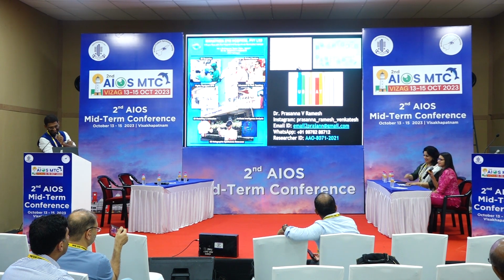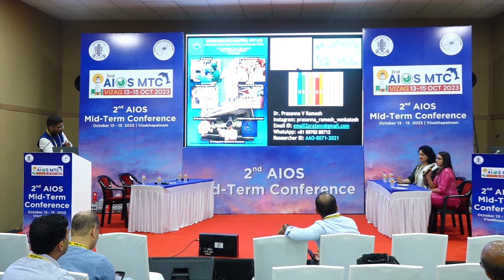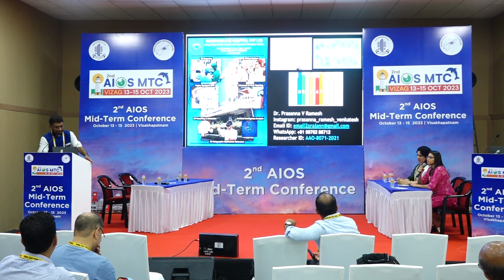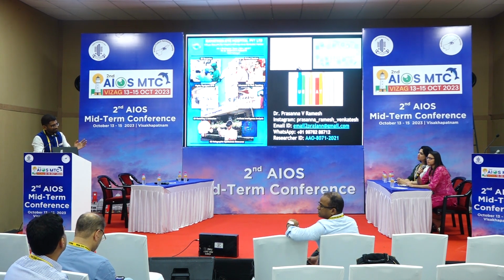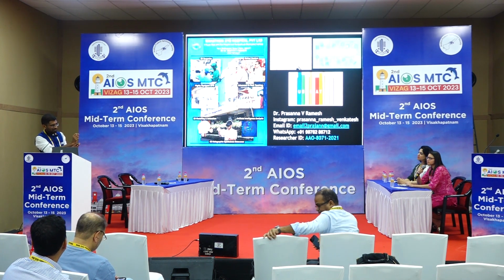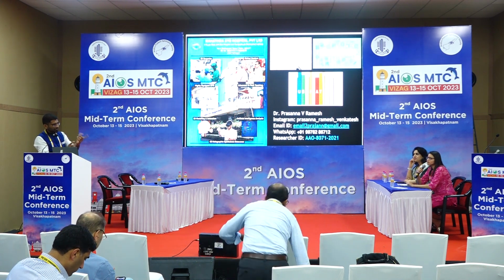Yeah. I have a theoretical question: even in the Cirrus Zeiss OCT, is only BMO-MRW measured, or BMO-HRW? Ma'am, in Zeiss, I am still thinking in terms of BMO-HRW. You do have that red spot present, and there is always a manual measurement where you yourself can measure the minimum distance between the ILM and the BMO opening, the Bruch's membrane opening, which will be the MRW.